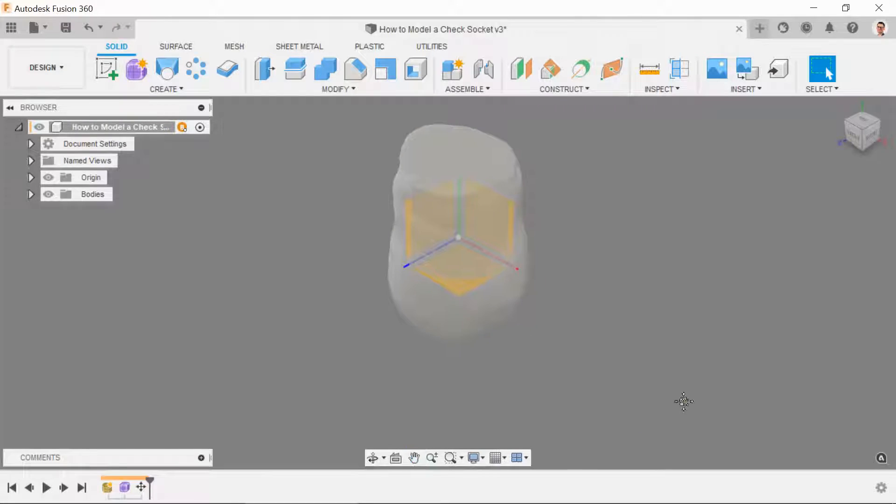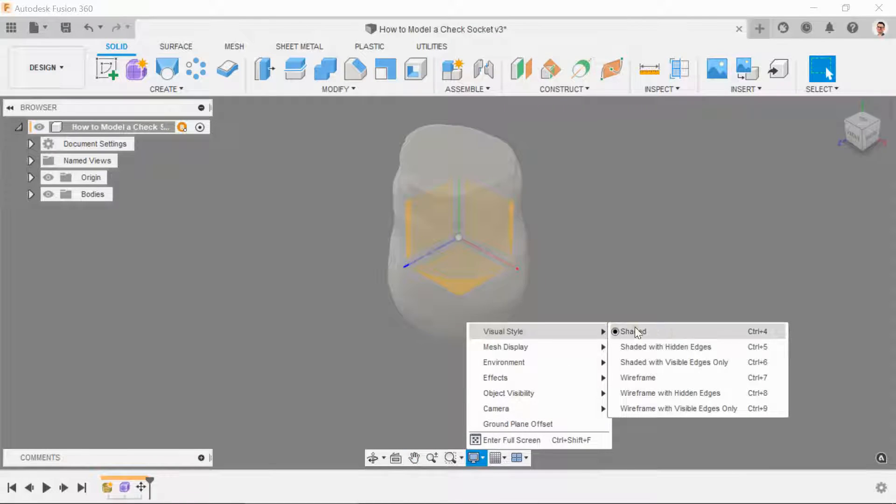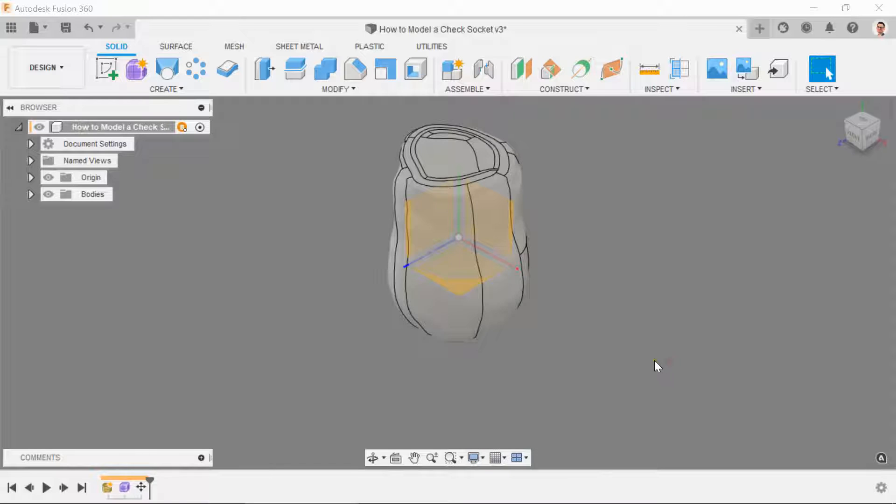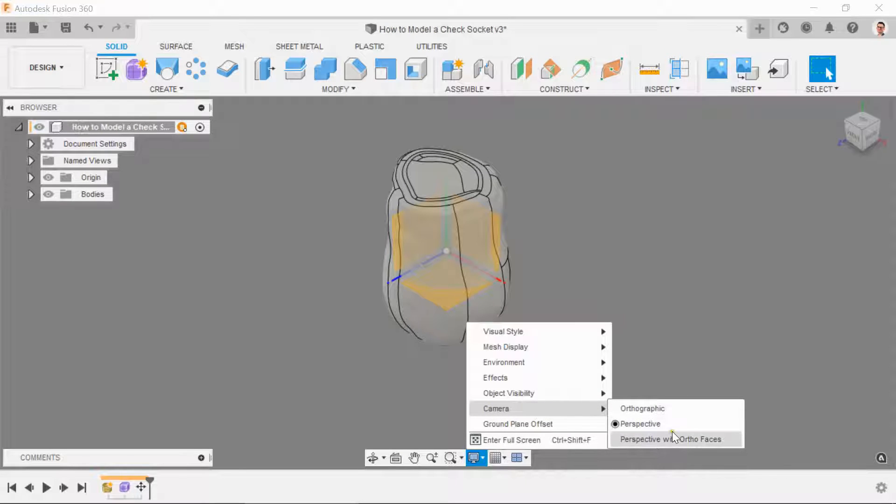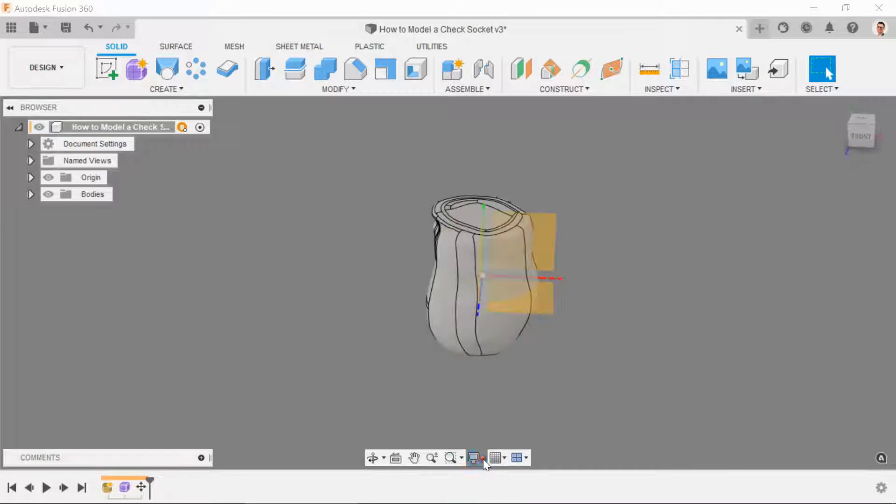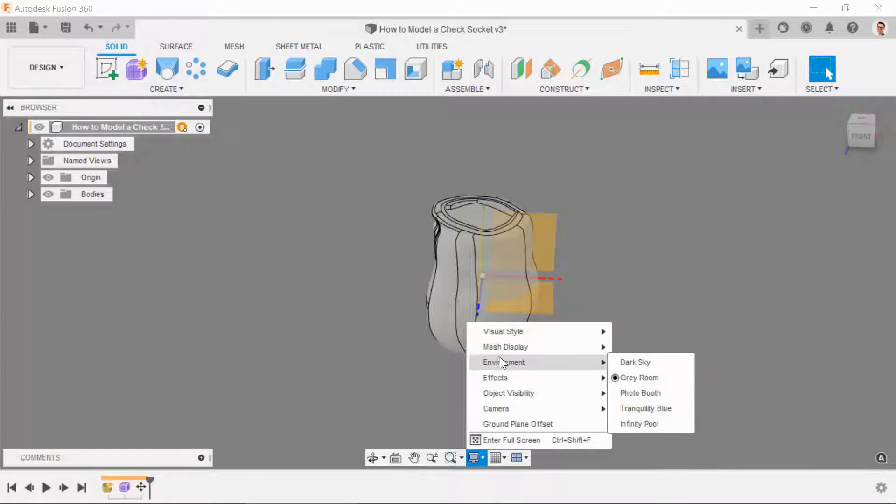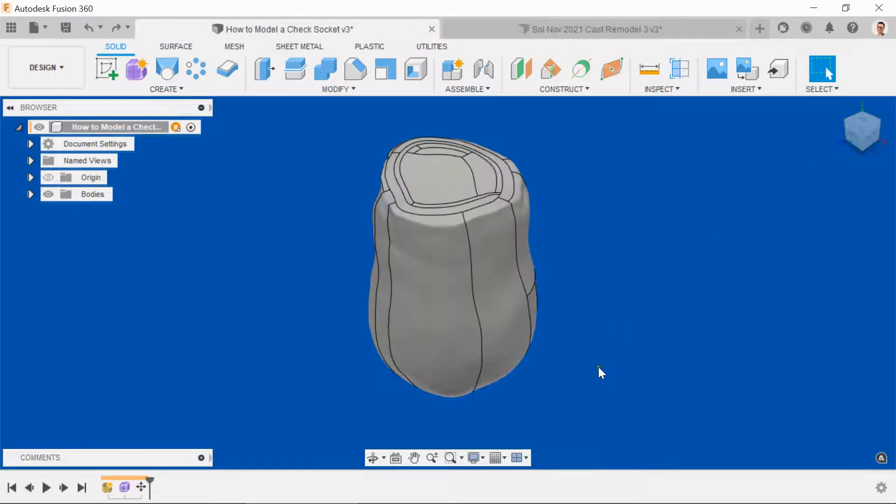First thing we need to do is go into the display settings, select visual style, and then choose shaded with visible edges only. Then go back into the camera settings and I like to pick perspective with ortho faces. Finally, you can also change the environment that you're in just in case you're sick of looking at a grey screen. Let's pick blue. Much better.